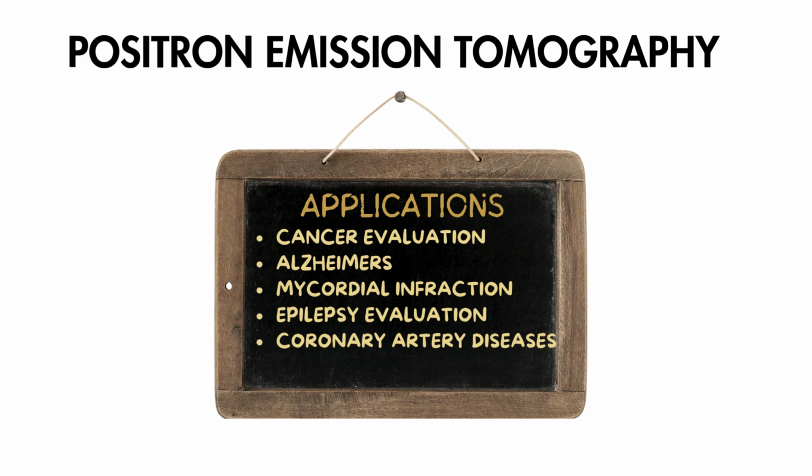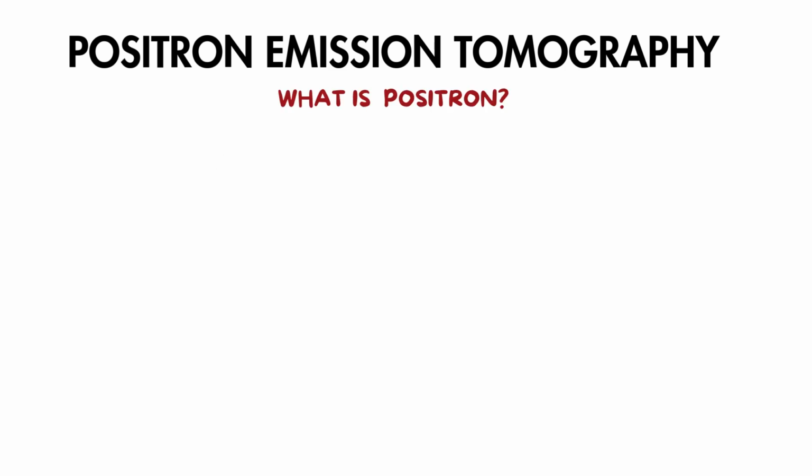Now, getting into the topic, PET, positron emission tomography. We'll look into the part of tomography. Tomography, as we know, is an imaging technique where you slice things and put them together in the final image. Now, what is a positron?